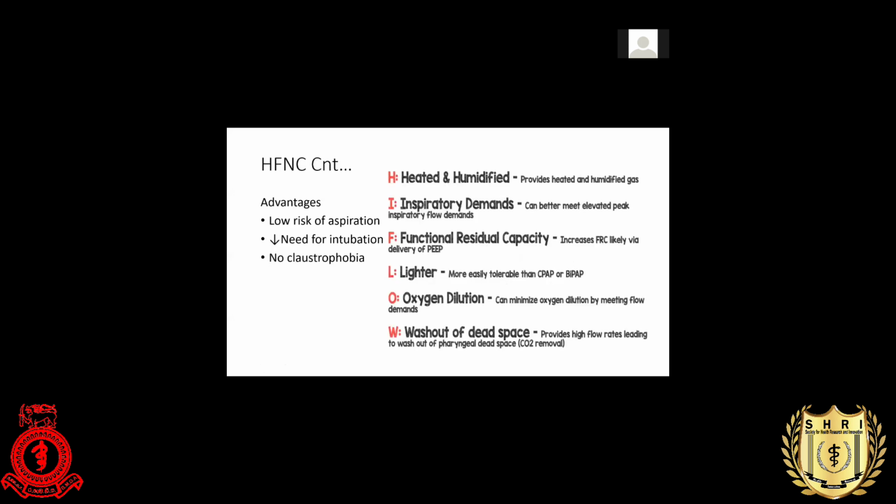In a nutshell, this high flow nasal cannula provides heated and humidified air. It also matches the patient's inspiratory demands by meeting the patient's peak inspiratory flow demand. It also increases the functional residual capacity by making a small PEEP and providing a continuous flow. It is lighter when compared with the CPAP or BiPAP machine.